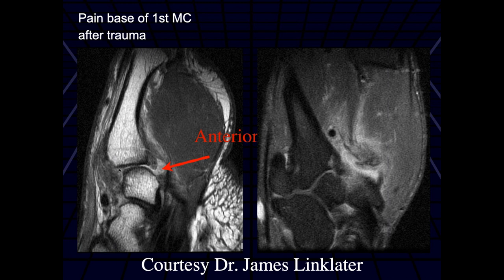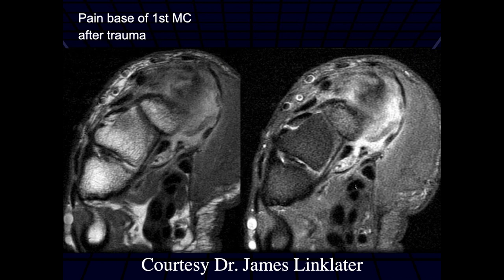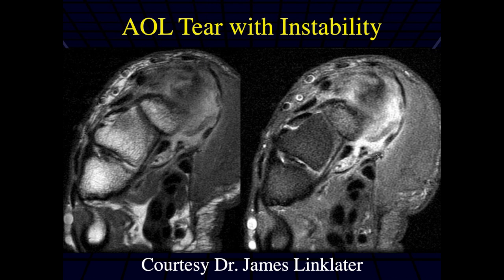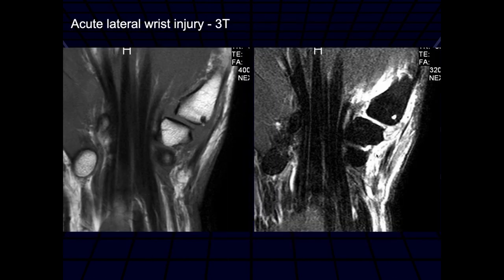I think it's really a high-grade partial tear with a lot of thickening in that posterior oblique ligament. We can see a lot of edema in the adjacent muscles, and disruption of the adjacent muscles. So this was a high-grade partial tear of the posterior oblique ligament and a complete tear of the anterior oblique ligament with strains of the adjacent muscles.